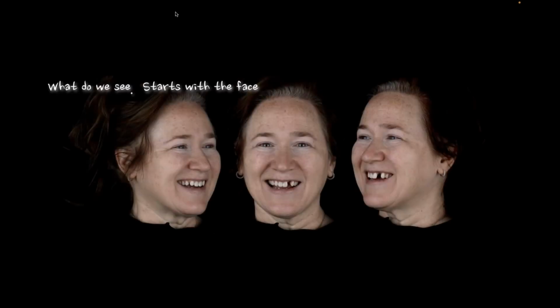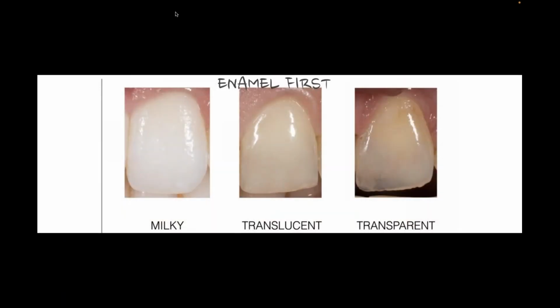Now, I said everything we do starts with the face, what we look at. And when I look at the face, you can see a happy-go-lucky patient. She's missing tooth number 10, and she wants to replace that. I'm going to tell you that it's going to be an implant. But before I start, I'm going to kind of reverse how you take your shades.